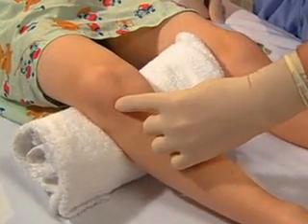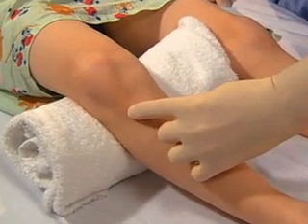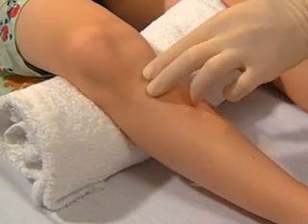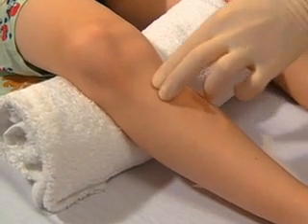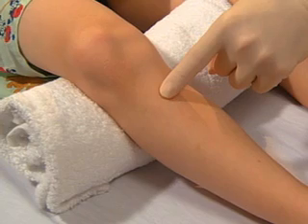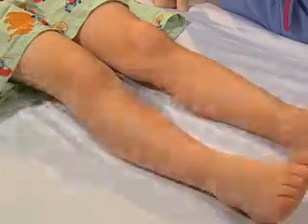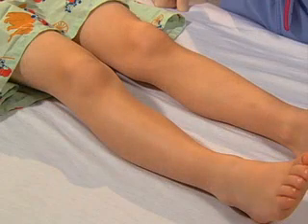Identify the lower pole of the patella. The prominence immediately below it is the tibial tuberosity. 1 to 2 centimeters inferior and medial to the tuberosity is a broad, flat surface of tibia that serves as the targeted insertion site. The distal tibia has easily palpable landmarks in most patients.